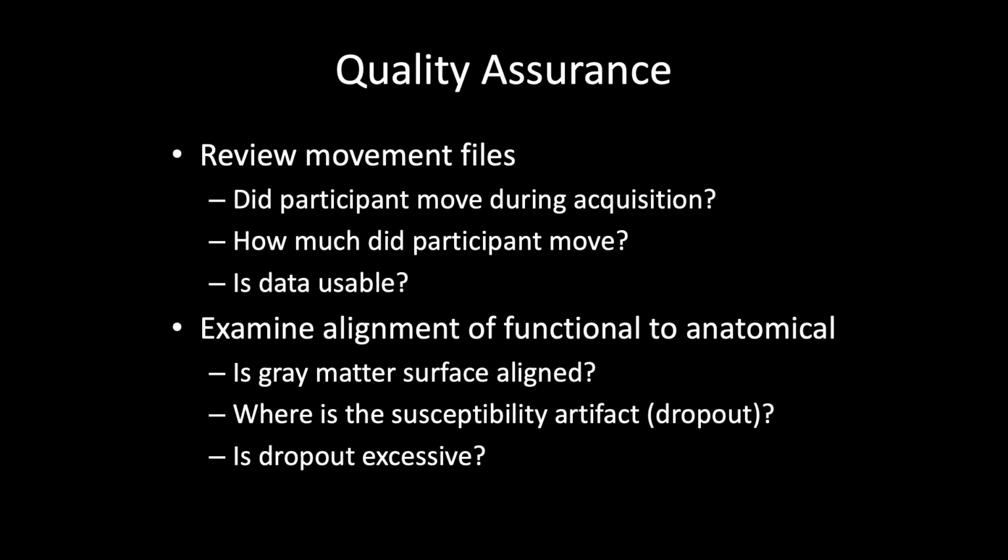It also matters what task you're doing. So if you're doing resting state, it's really sensitive to motion. So you ideally want as little motion as possible. So that's one of the things you'll look at.